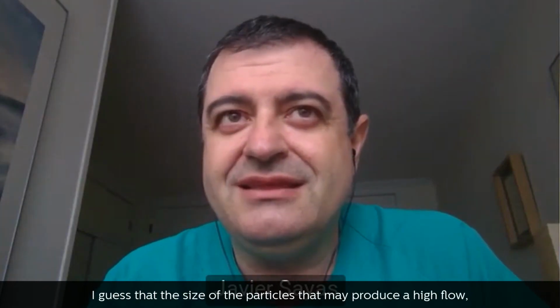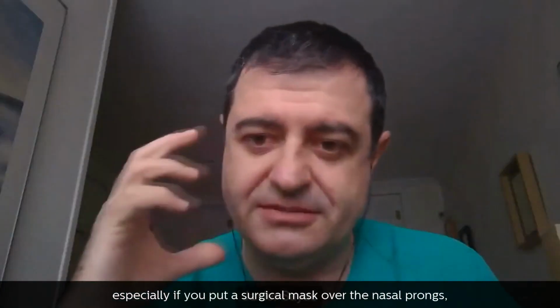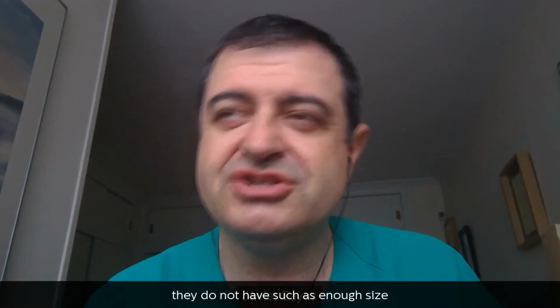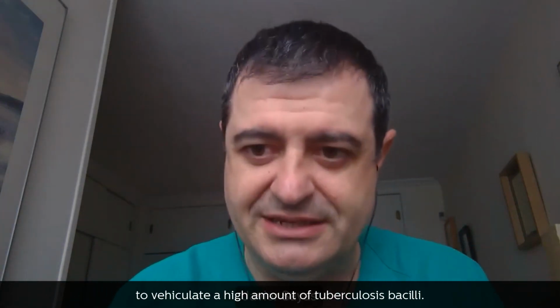I guess that the particles that may be produced by a high flow, especially if you put a surgical mask over the nasal prongs, may not be of a size sufficient to convey a high amount of tuberculosis bacilli.